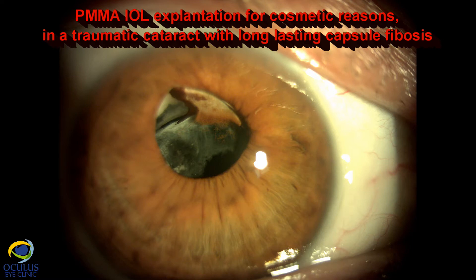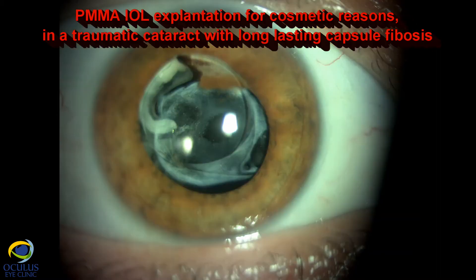I'm Dr. Roxana Mororo and I'm going to present a case of a traumatic cataract operated 20 years ago with a PMMA IOL. The patient was not happy and came for improvement, if possible, for the improvement of the cosmetic appearance.